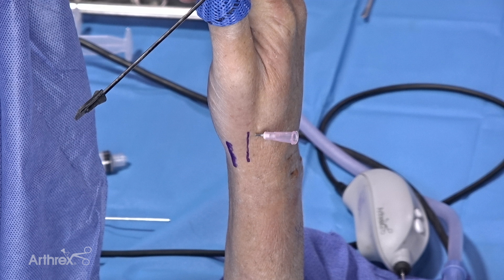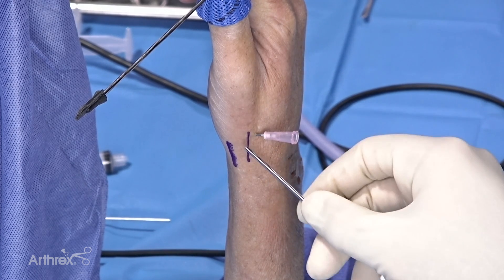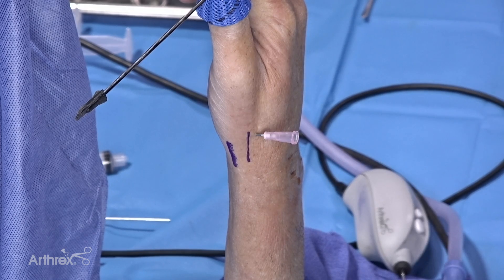Next we're going to be doing a thumb CMC arthroscopy. With the current technology using a small camera like a 1.9 millimeter scope — that's what we use for the CMC joint — but the problem is it's very easy to damage the scope and cause cartilage injury. What we've marked out here, using the nanoscope we're going to be using today, is the first dorsal compartment. We're making a 1U portal.